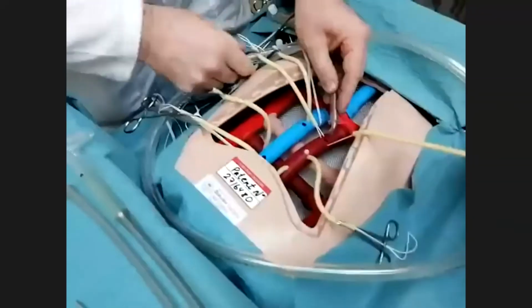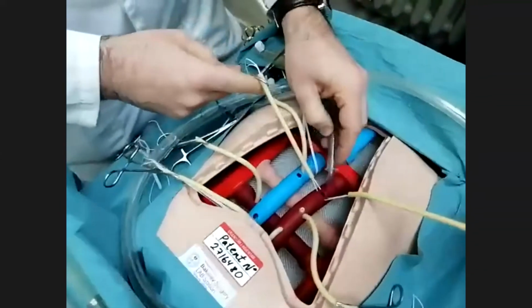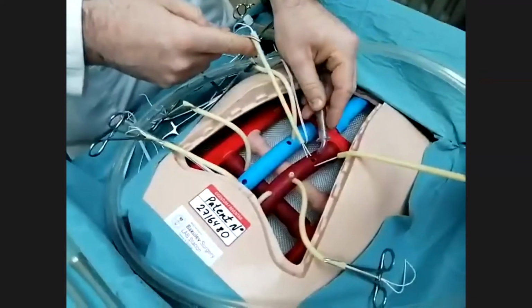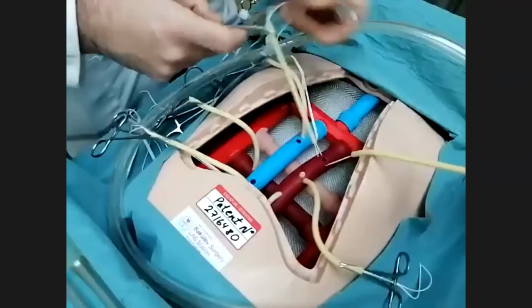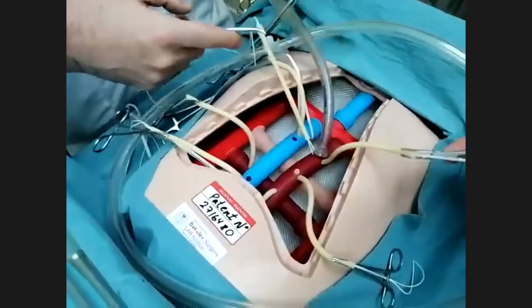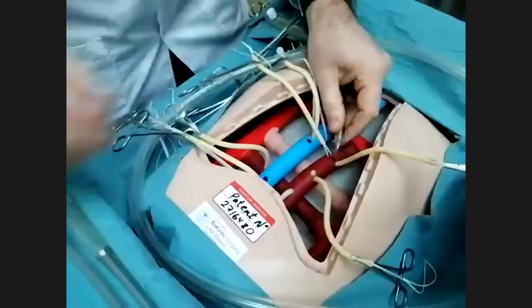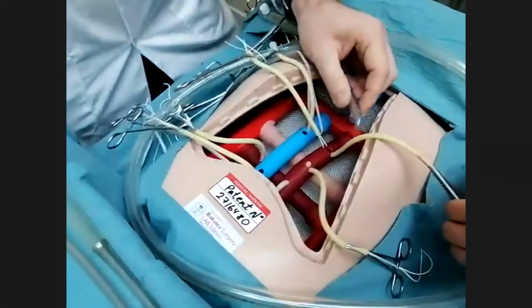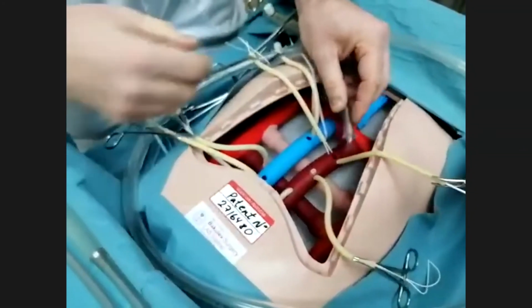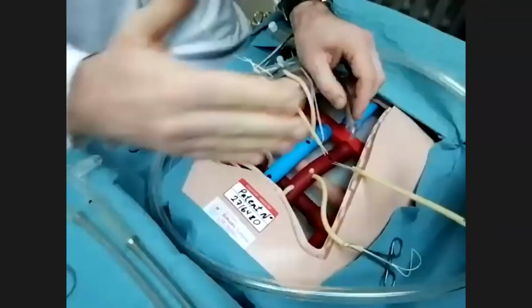And we have the hole here because it's very easy to insert, and the surgeon does not spend time thinking about how I should do this, and she's concentrating on the steps of this procedure.